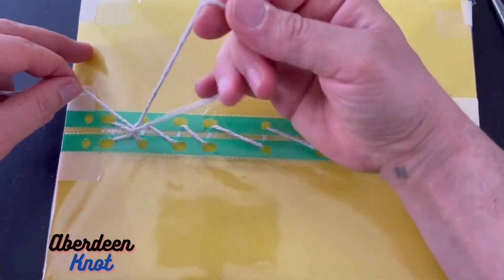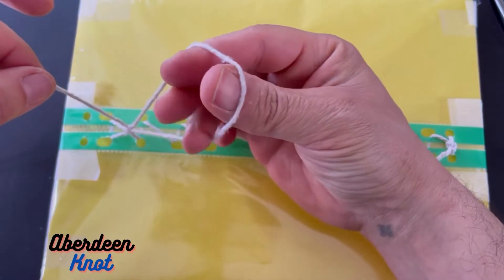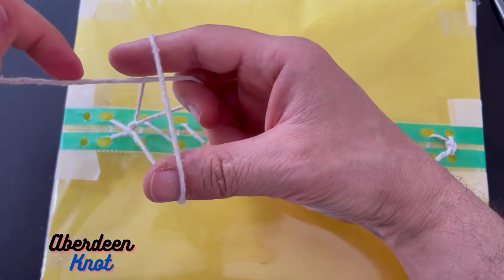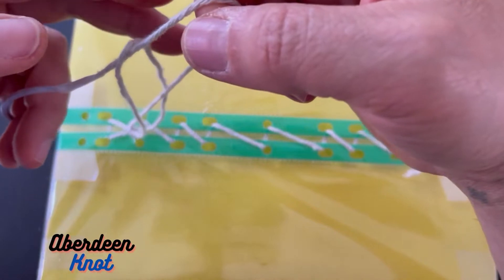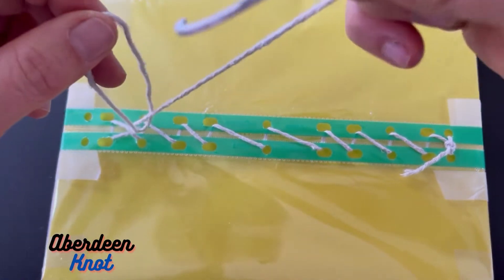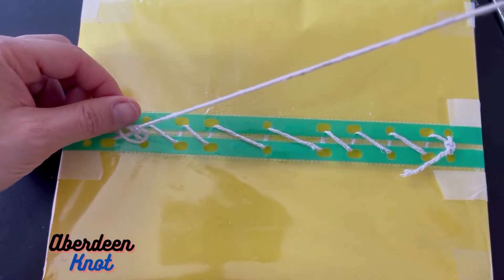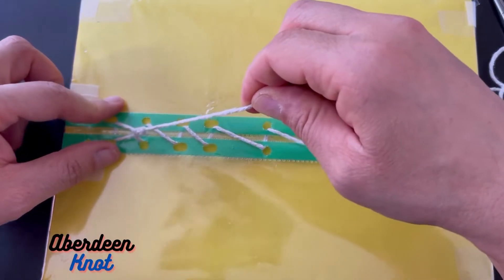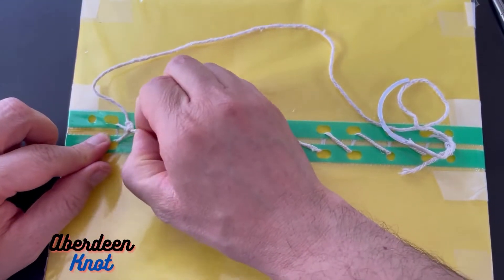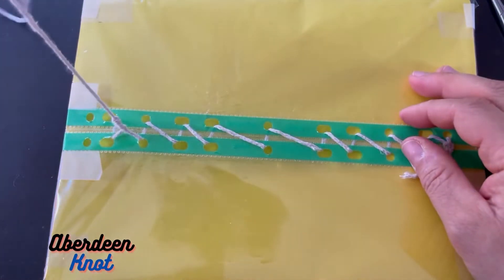Again thumb and middle finger — index finger holding the loop, middle finger pulling — keep pulling until it's knotted. That's where we reached last time. Now to lock it: thumb and index finger as before, middle finger goes in, but this time I let go so the middle finger keeps pulling and pulls the needle through the loop on the other side. Now you can see it's gone through the other side. Keep pulling — that's now locked. I cannot pull it, I cannot undo it. That's the Aberdeen knot.